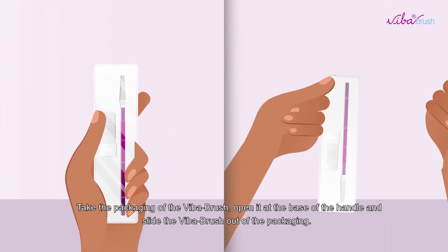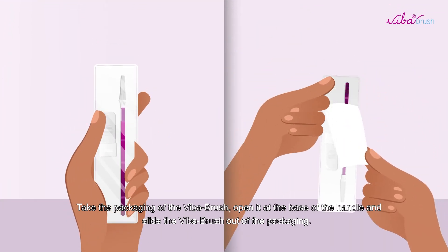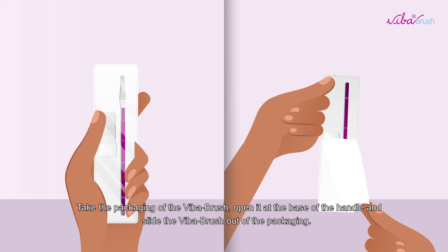Take the packaging of the Viba-Brush, open it at the base of the handle, and slide the Viba-Brush out of the packaging.